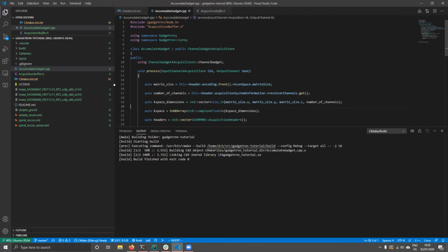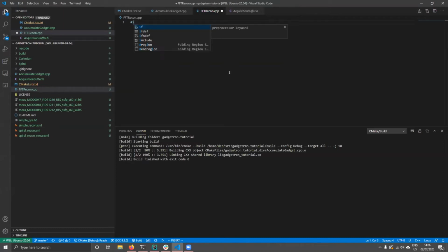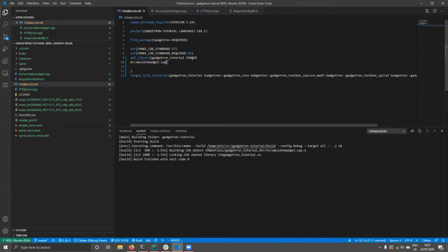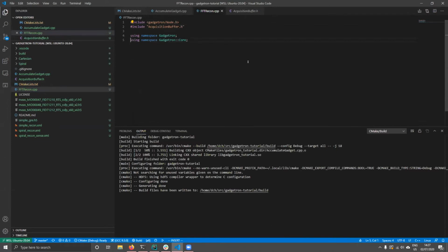Yeah, that was fortunate. And we can make our next gadget. I'm gonna call that FT Recon. It's not gonna be super fancy. We're gonna start with a lot of the same stuff we had in the other gadget. And let's go ahead and add that to the CMake file. So we can get some help from the editor.